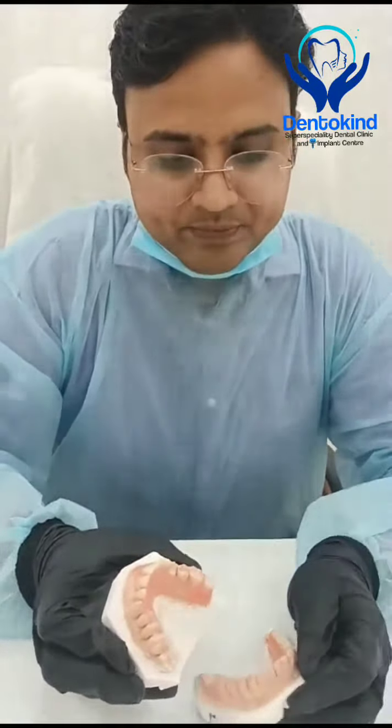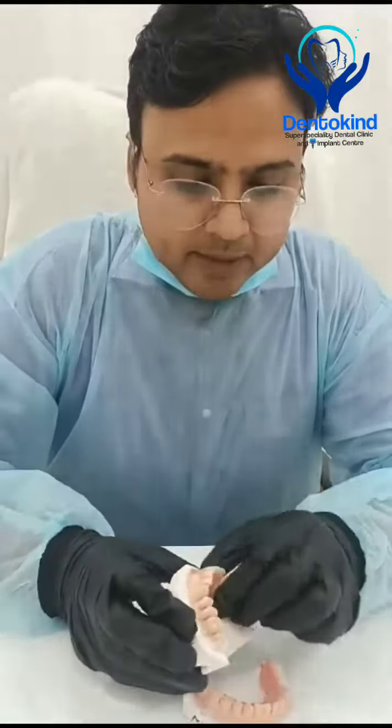I'm Ganesha Gupta, and today I am presenting a new case of flexible upper and lower partial dentures for a patient, Richard Myers. These are upper and lower flexible dentures I have made for them.